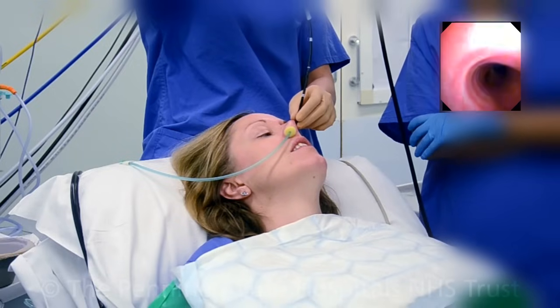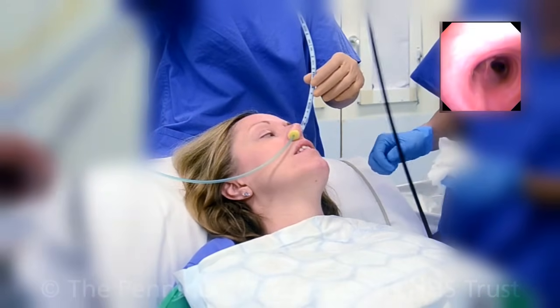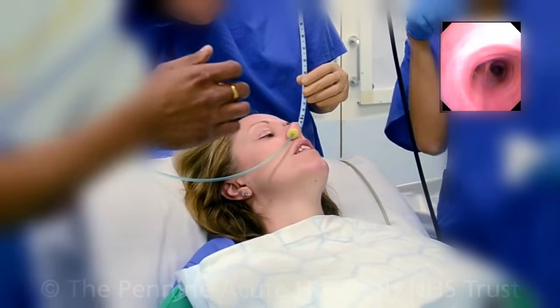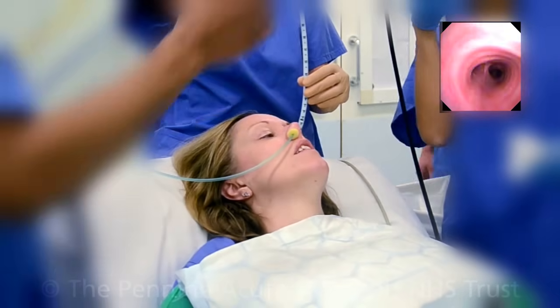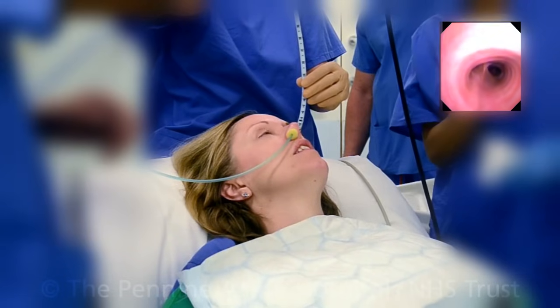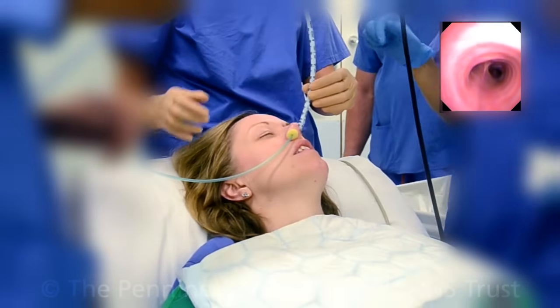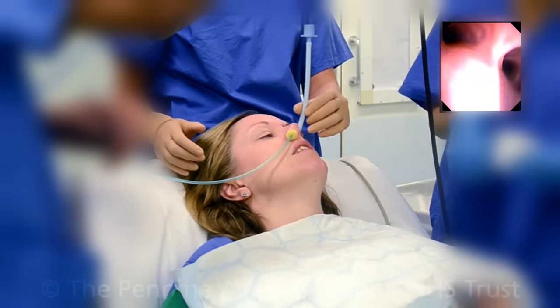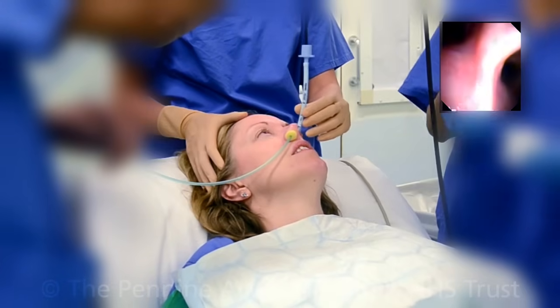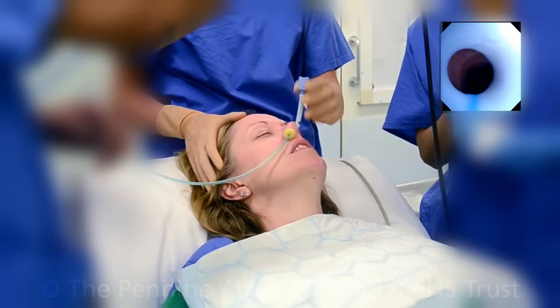Once we are satisfied that we are in the correct position, the breathing tube will be passed into your airway. Sometimes you may feel some pressure as the breathing tube passes the nose, but this is not painful.